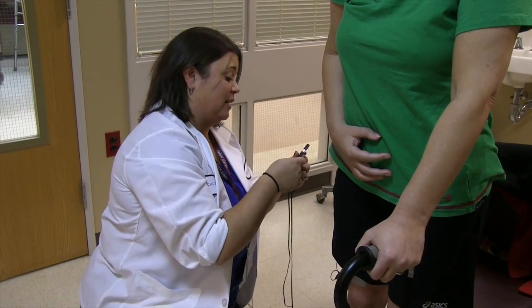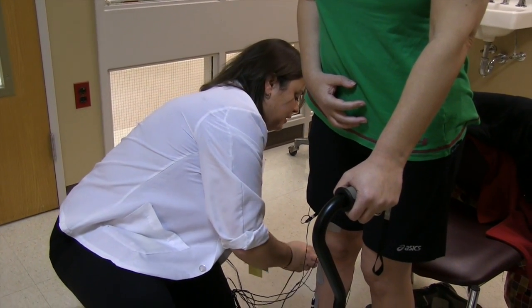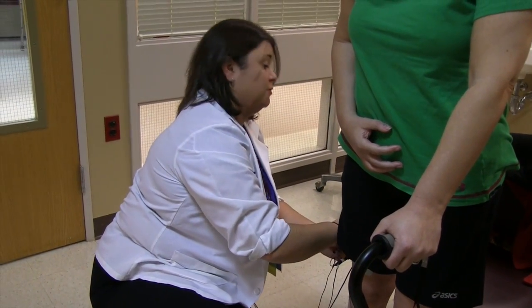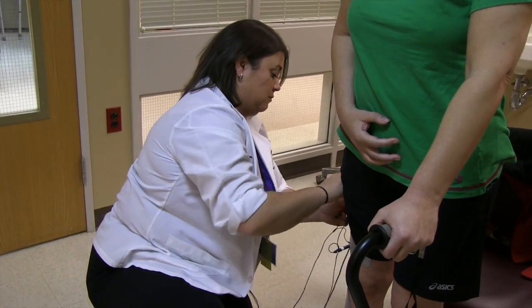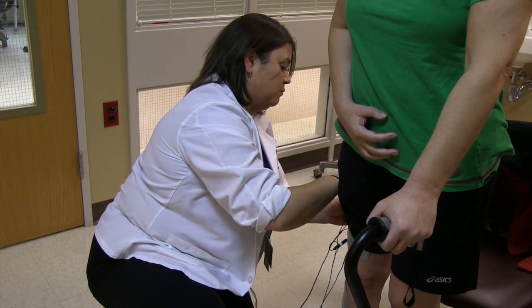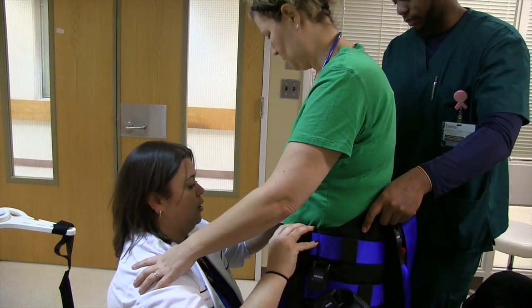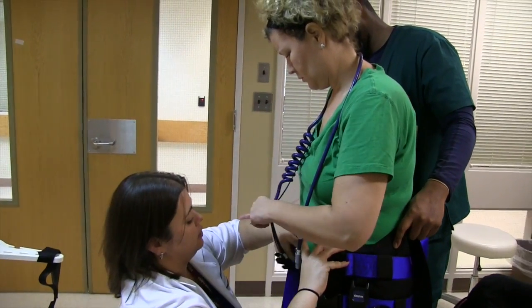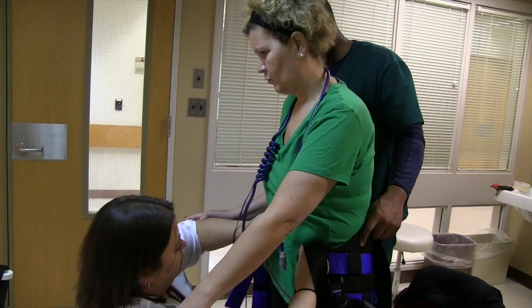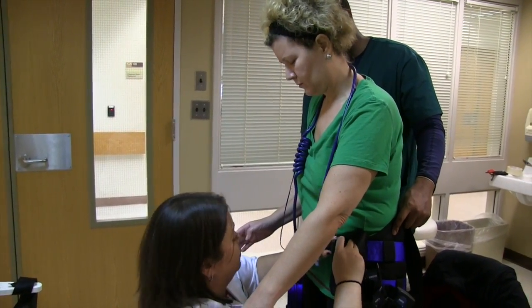Now I'm going to attach the wires to all of the muscles that are going to be stimulated. The cable will talk to the computer and fire the muscles at the right time during the gait cycle, stimulating walking as if your muscles were working the way they had prior to the stroke. This is also providing body weight support so that as you start to get better contractions, you'll be able to take more of your own body weight on the stepper to simulate walking over ground.